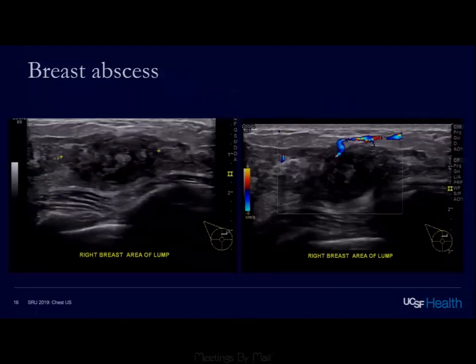So here's an example. This was one of our cases. It is a patient who was 4 months postpartum. She is breastfeeding, had recurrent episodes of mastitis. So she came to our department for imaging evaluation. And our imaging reveals a hypoechoic, heterogeneous area within the breast tissue. Not really that much drainable fluid component. So this is a phlegmon or early abscess with little drainable fluid component.